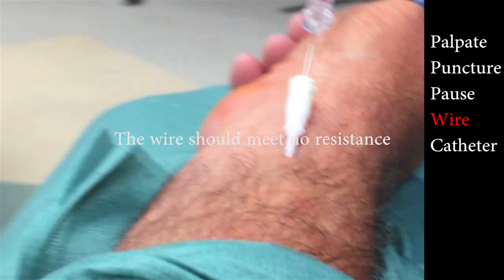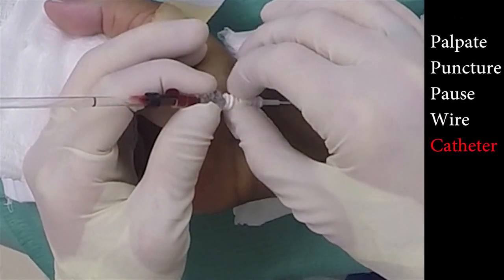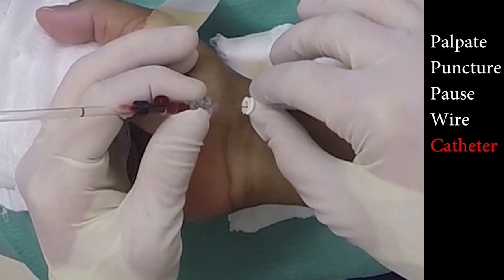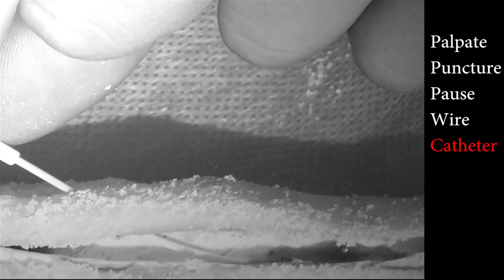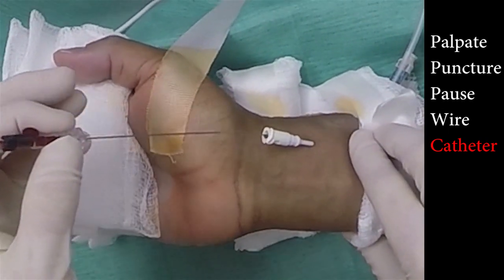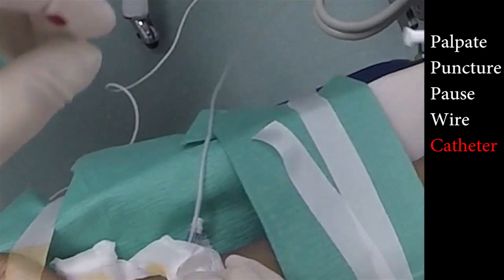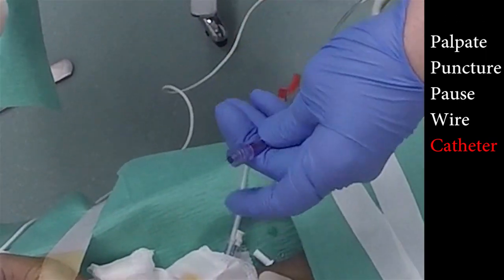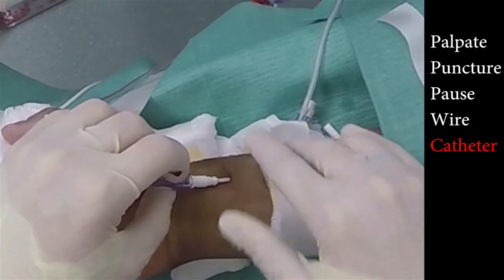Another thing that can help is dropping your angle even further. Finally, we come to step five. Using constant pressure or a twisting motion to overcome the resistance of the skin, place the catheter in the artery until you reach the hub. The Arrow introducer can now be retracted and discarded. Keeping pressure on the area just proximal to the tip of the catheter will prevent blood from leaking out once this is removed.